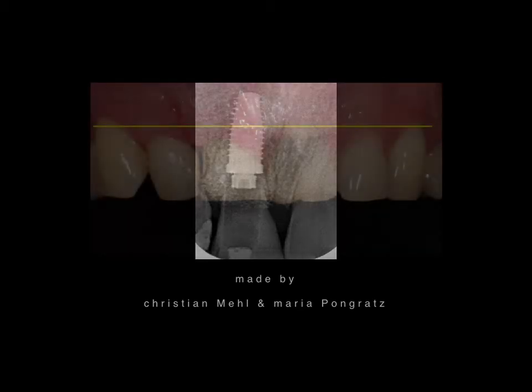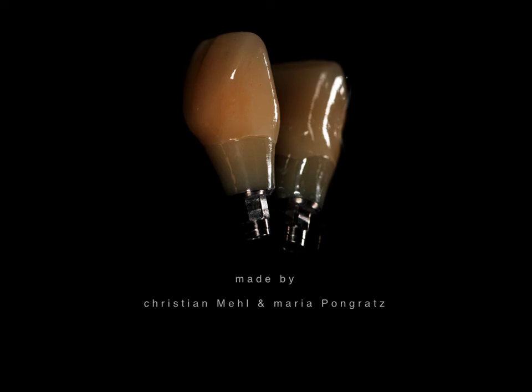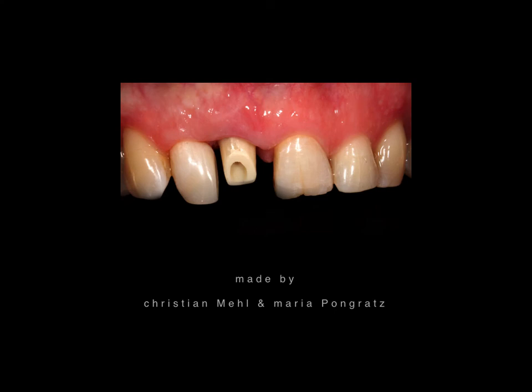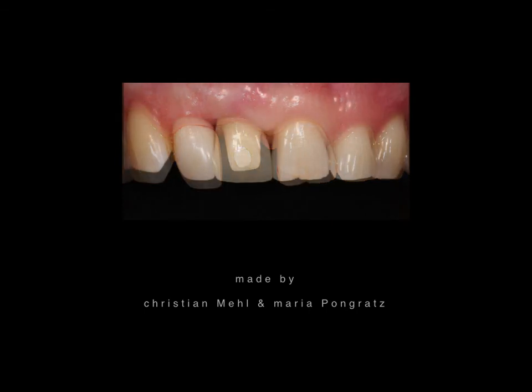This is the X-ray directly after the implantation. You can see we're safe when it comes to the vertical tissue situation, but distally the papilla is gone because of inflammation. And here we can see then 3 months later the final restoration, and the abutment is placed in position, and we'll in this case cement the crown, as otherwise the exit of the crown, the screw channel, would maybe have impeded nice aesthetics because of the way it would break through the incisal edge.